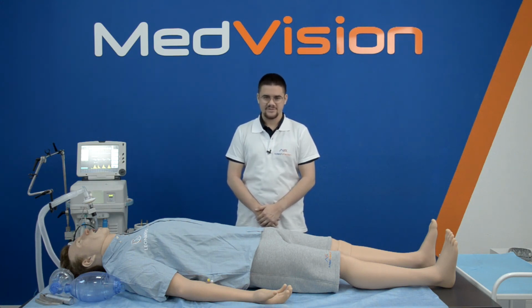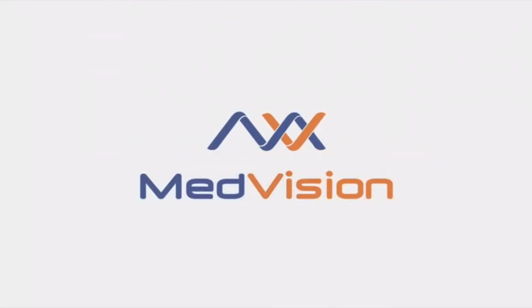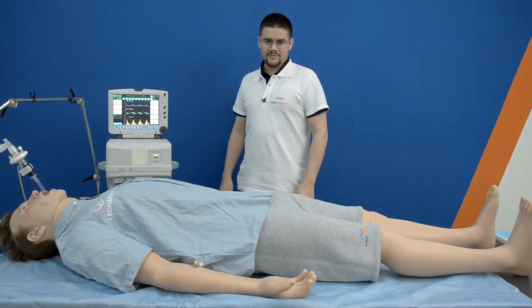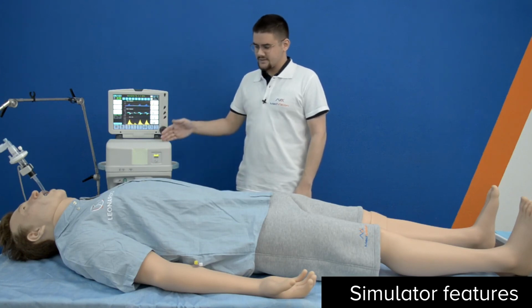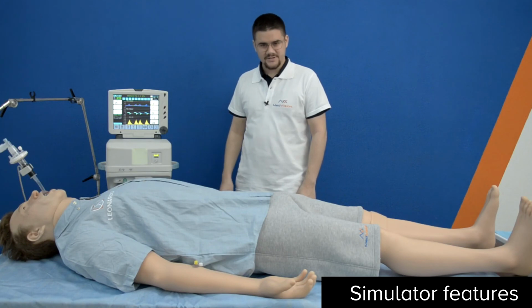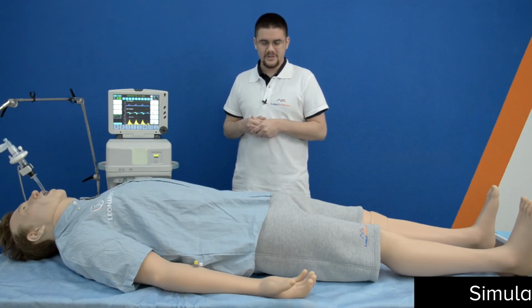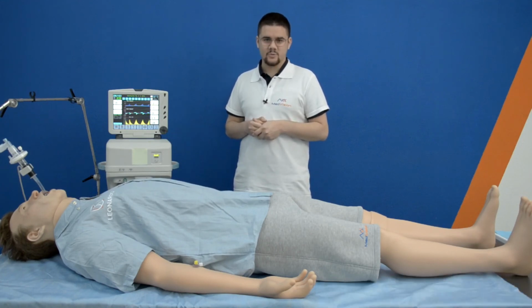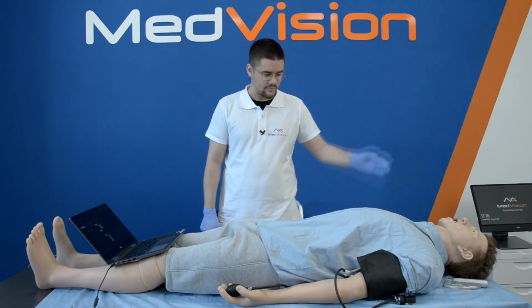I'm the Pre-Sales and After-Sales Director at MedVision Europe, and in this video we would like to show you our highly realistic patient simulator, Leonardo High Fidelity. One of the most important features of MedVision patient simulators is working with real devices, and mechanical ventilators will see Leonardo High Fidelity and other simulators as real patients and will act accordingly. You can set different parameters and introduce complications for a complete respiratory training, including scenarios where we see complications after COVID infection. Let's begin our demo of Leonardo High Fidelity simulator in our classic approach from head to toes.